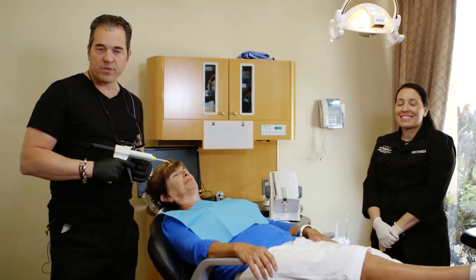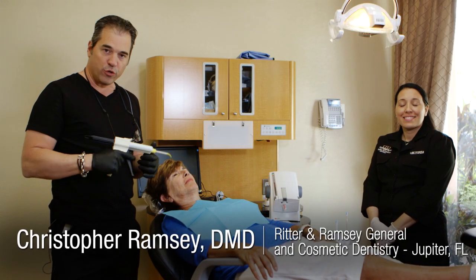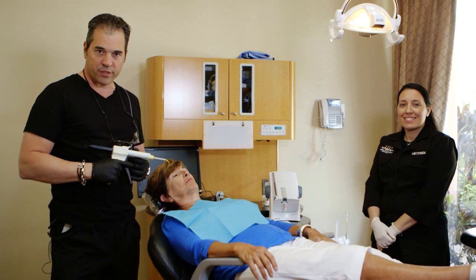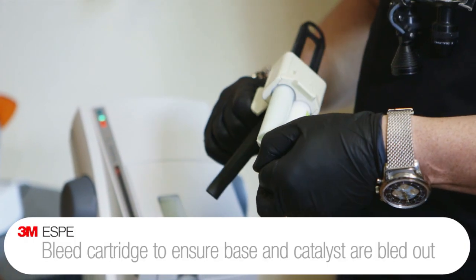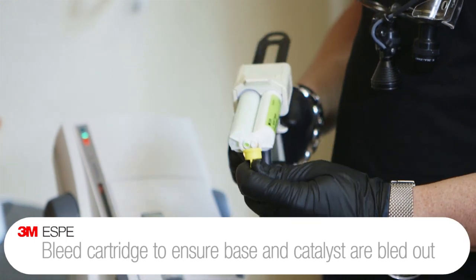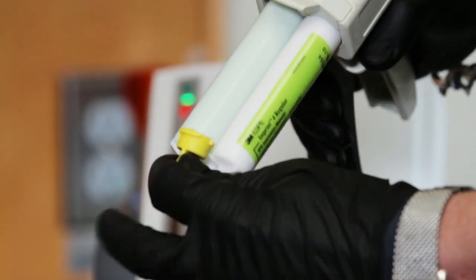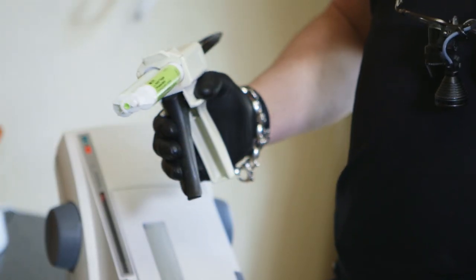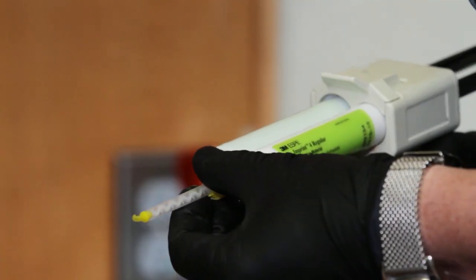Hi, I'm Dr. Christopher Ramsey, and today we're using 3M ESPE's product Imprint 4 to load into a full tray so we can get a full arch impression. With any light body, we typically want to bleed the cartridge. It's always a safe bet to make sure that the base and catalyst are bled out. And so we're gonna get rid of that. Then we'll go ahead and load our tip, and we are ready to roll here.